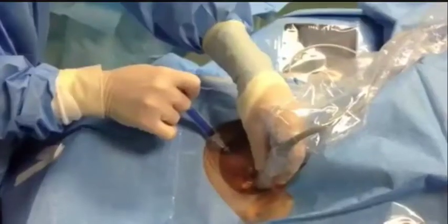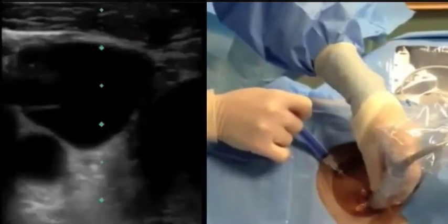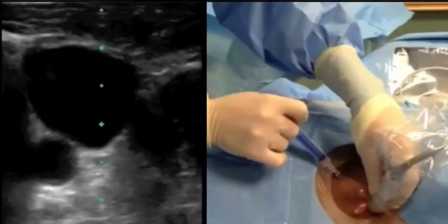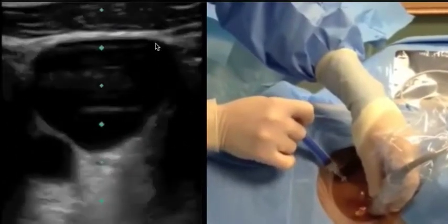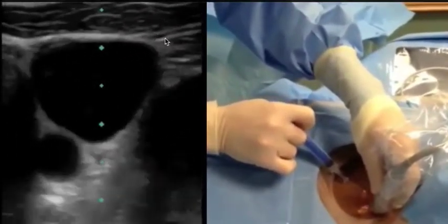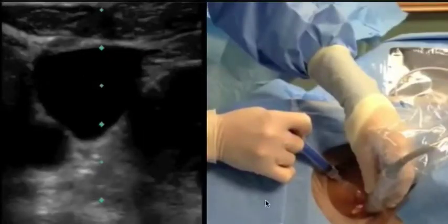At this point, we are ready to scan the patient again and identify the best point of entry. With the vein in the center of the probe, the needle is also inserted in the center of the probe, and the tip is visualized immediately upon entry through the skin. This is a short axis demonstration. In this example, you can see the needle tip appear just lateral to the vein; therefore, insertion is stopped and redirected to the center of the vein. The probe indicator is on the same side as the probe indicator on the image — the left in this example — so that at all times you know the left from the right during the procedure.